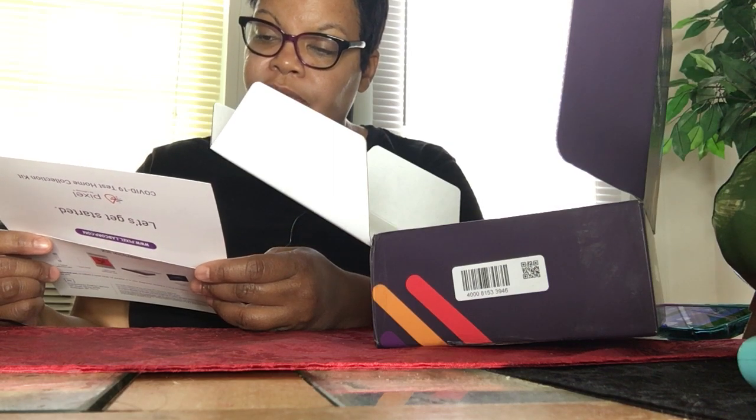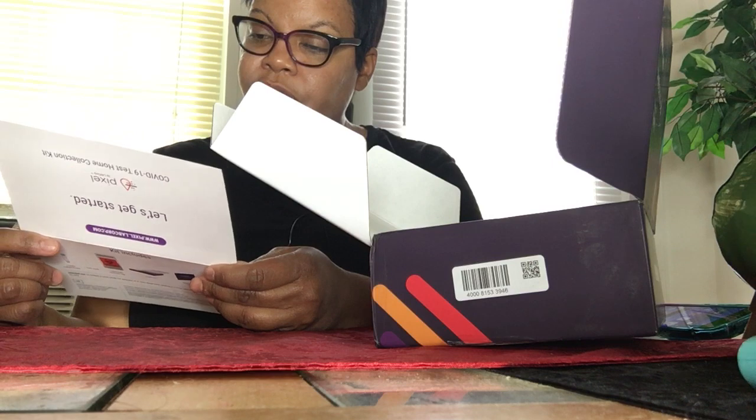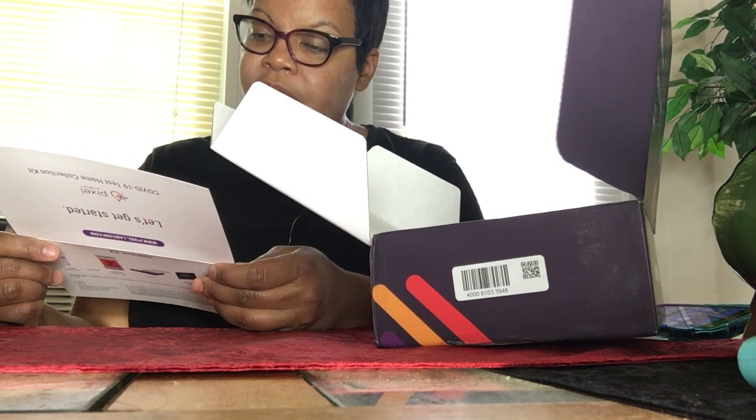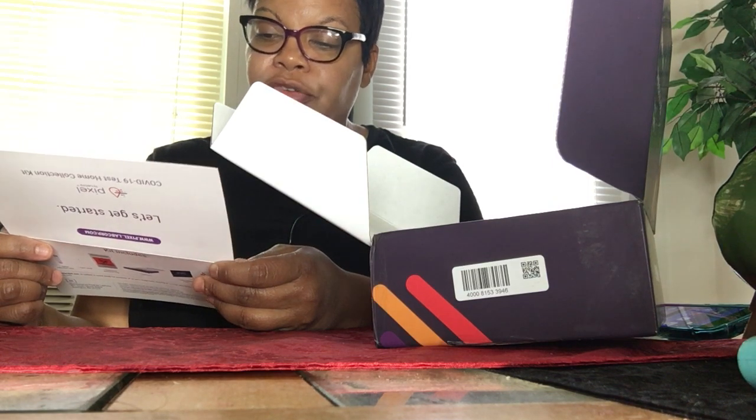I'm just reading the instructions. Take the foam swab out of its package. Do not touch the tip of the swab with your hands. Unscrew the top of the collection tube. Hold the swab in one hand and the tube in the other — be careful not to spill the liquid. Do not drink the liquid.